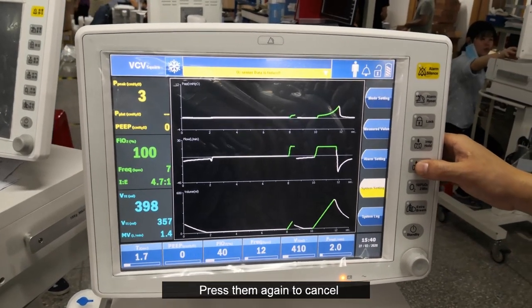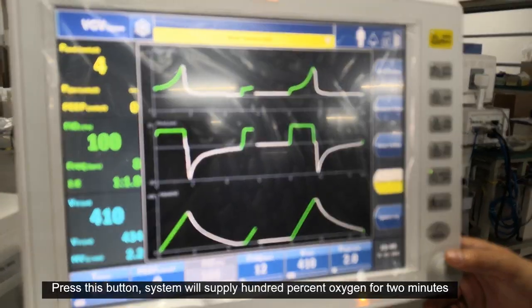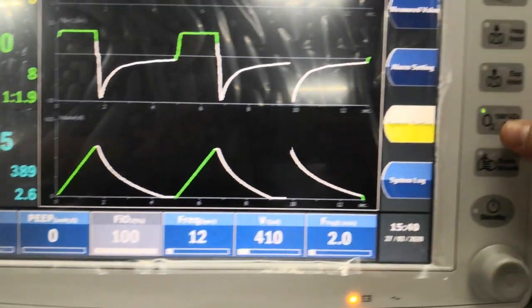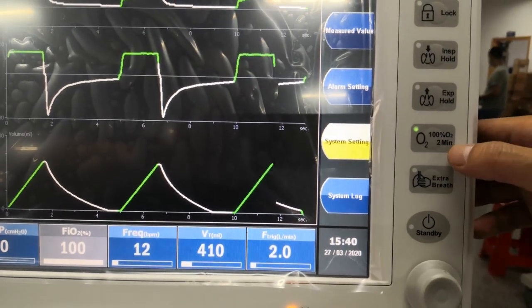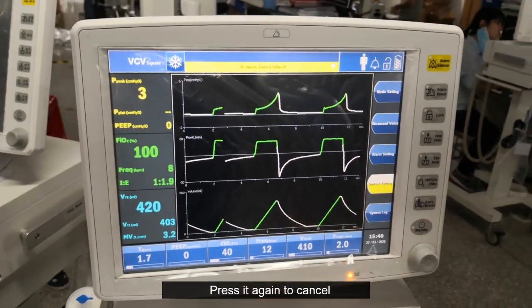Press them again to cancel. Press this button and the system will supply 100% oxygen for 2 minutes. Press it again to cancel.